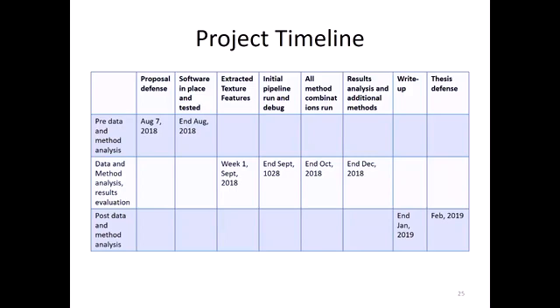In the fractal analysis, I've gotten software that will do various wavelets, so I can use that for wavelet decomposition, and I can run that against tests and say, okay, am I getting this done? Which I have done. I'm using Gabor wavelets on it initially. And then I've written the software to do the fractal dimension calculations, which is a box counting method, and I already have it verified. I've got elastic depth. I haven't tested it out yet, but that's one thing I want to do: run test samples through that, just to make sure it's working before I start tying them all together.